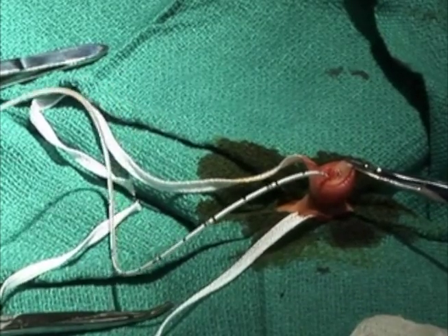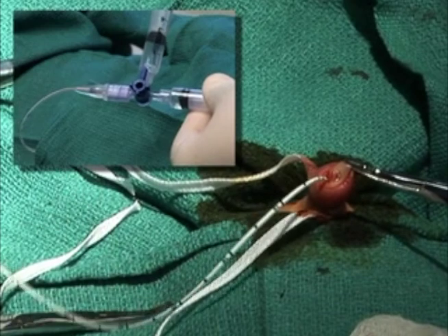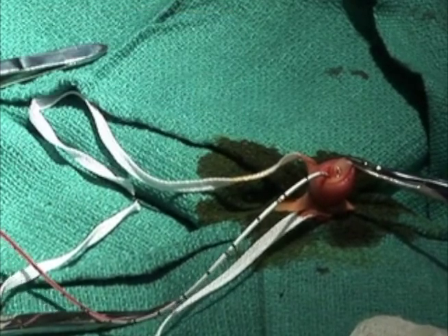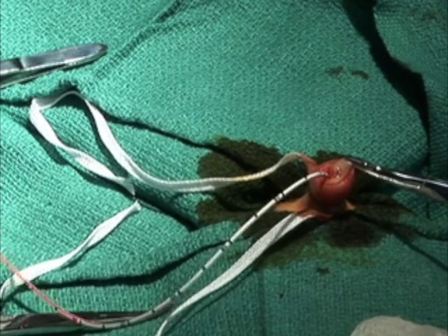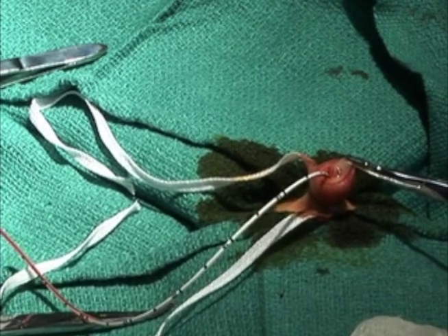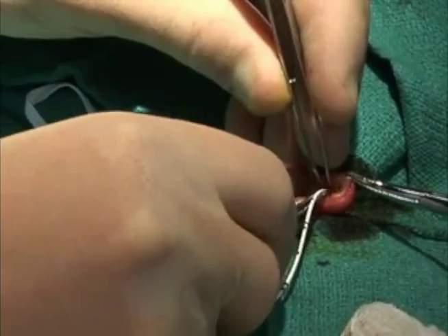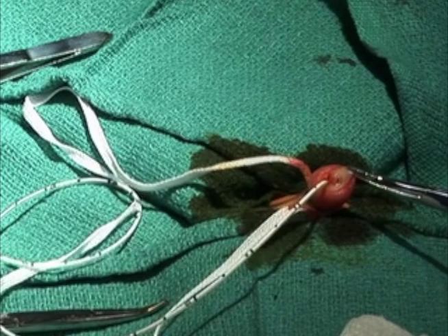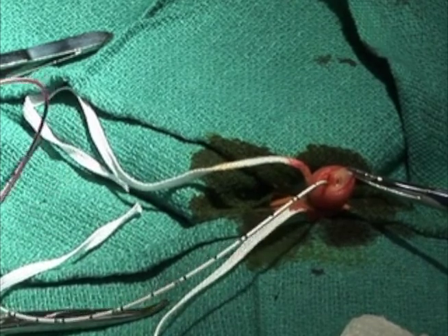Once a depth of 5 centimeters has been reached, draw back on the syringe to ensure the blood is able to flow. As the catheter is passed to the predetermined depth, you may encounter resistance at the curvature of the vessel, approximately 6 to 8 centimeters in depth. The vessel should slowly relax, not pop, as you apply constant pressure.